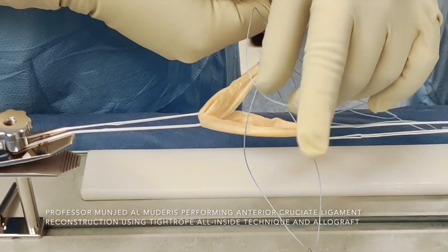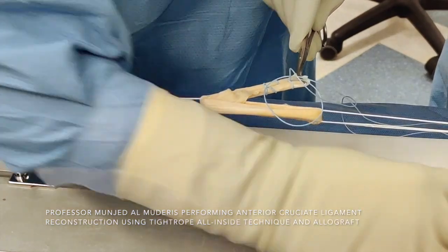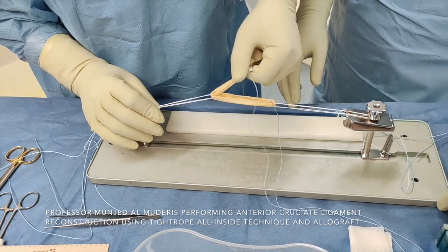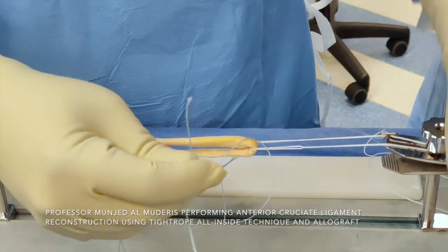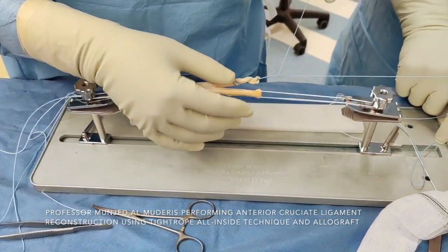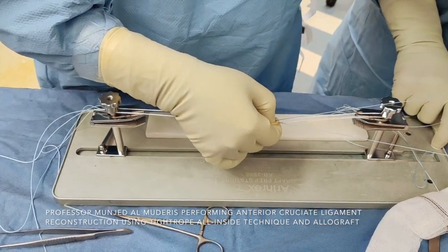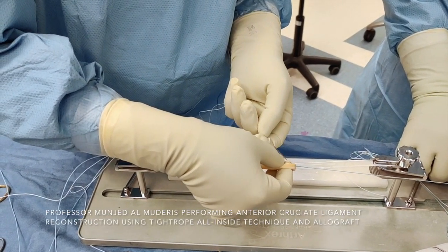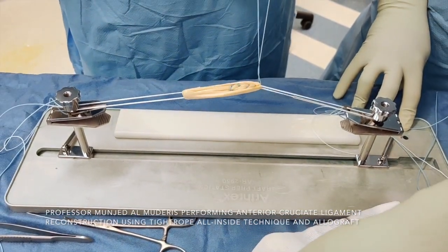This is the third pass. I then tension the station to the desirable length and make sure that all the parts are tensioned equally. I then divide the whipstitch suture in half. I exit through the external part from one end in the middle, put tension on that place, and exit from the other side with the other arm. I tie these two limbs together.